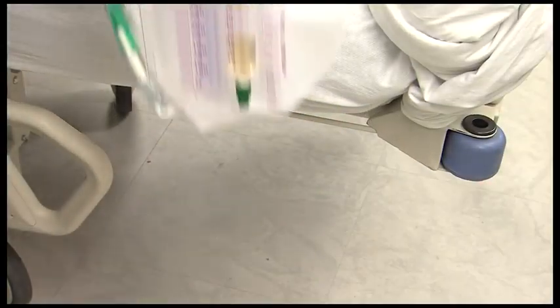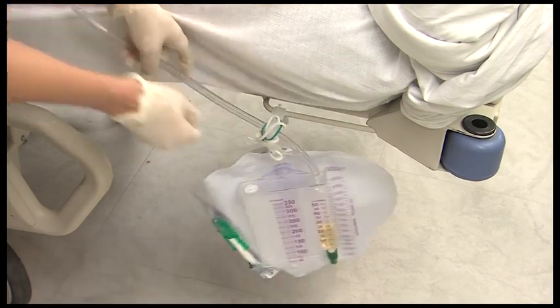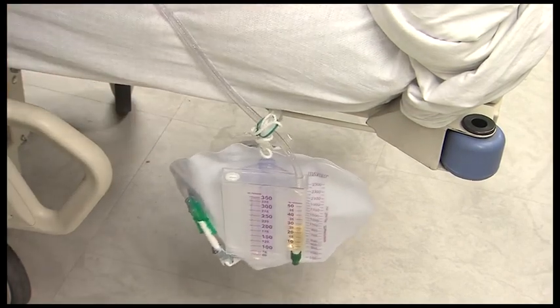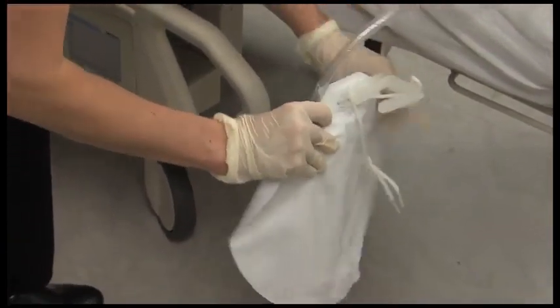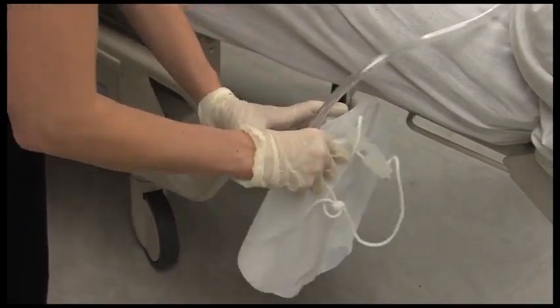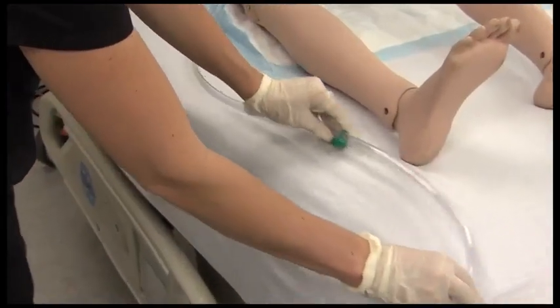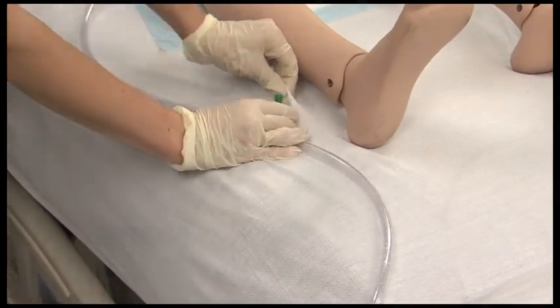Hang the drainage bag near the foot of the bed. The bag should always be positioned below the patient's bladder. The bag and tubing should never touch the floor. Ensure the drainage bag is completely unfolded. If a urine meter bag is used, you should exercise the spine of the bag. Arrange the tubing to ensure proper flow of urine into the drainage bag.